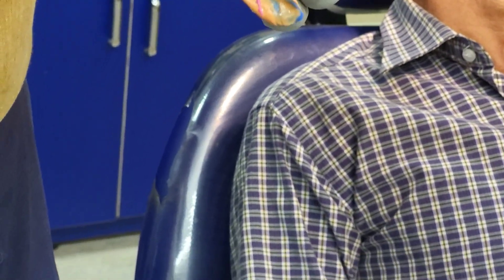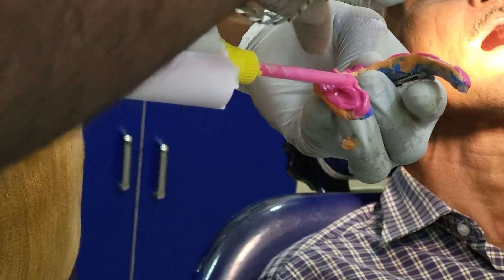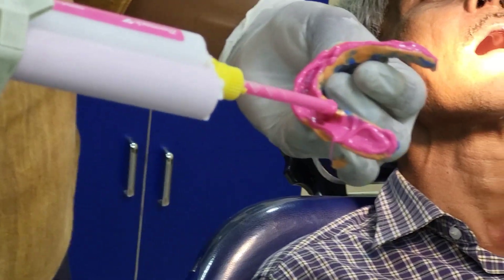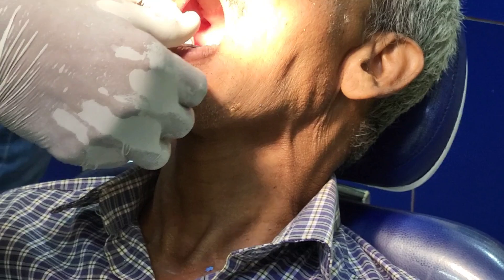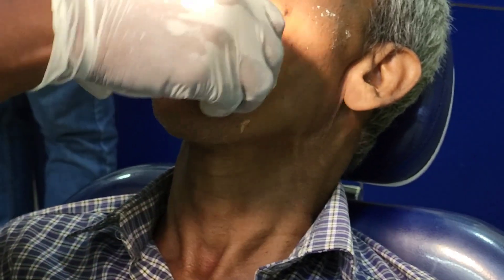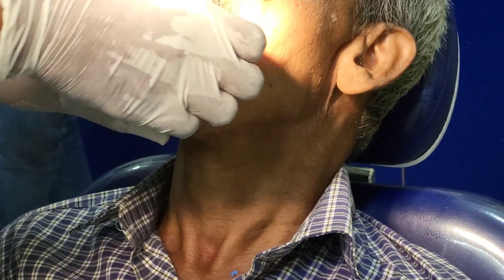The extra fine light body impression has been applied to the secondary impression and we are going to take one more impression. Since it is a BPS denture, we need to take two light body impressions. We can also apply this to our conventional single step border molding procedure — placing the mandible and making the buccal and labial movements, then asking the patient to protrude the tongue outside and move right and left to record the lingual sulcus region.